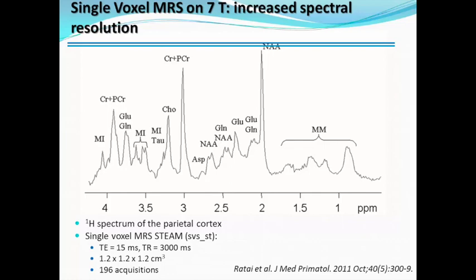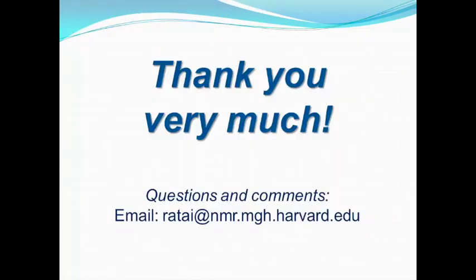You see aspartate, you see taurine, you see that myo-inositol is not just one peak, it's actually this triplet, and this is actually doublets of doublets. So it's way easier to analyze. And as I said, in psychiatric diseases where you're interested in just glutamate, it's definitely the way to go to higher field strength. So this is all I have for this. If we have some extra time, I'm happy to talk about J-coupling, if you're still up for it.